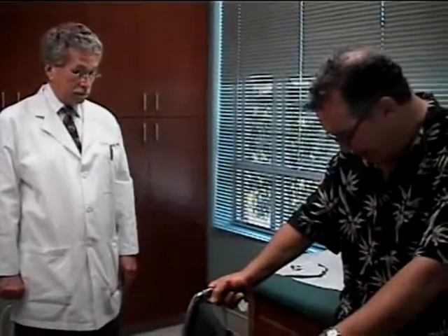It's easy to put on. I take it off for the shower. And how do I get the foot positioned?